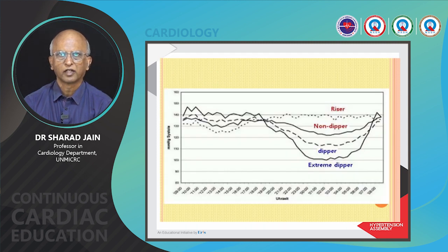This is, you can see, the non-dipper, dipper and extreme dipper.